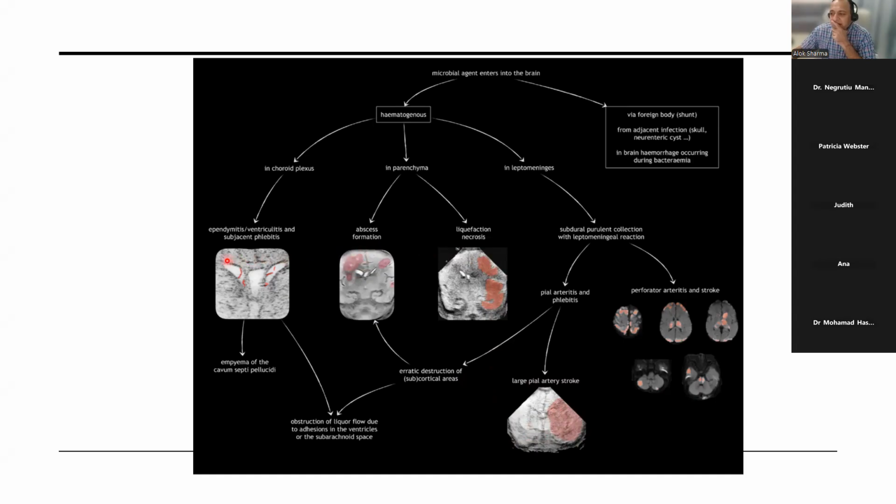And then the third system that you see in the brain is the collecting system, which is the ventricles, which collects CSF. And really, if you start seeing infection there, then you start seeing a brightness to the ventricular walls, exudate in them, or even affection of the choroid plexus. We call it plexitis. So really, it's inflammation there, and inflammation there can cause bleeding. So you can even get intraventricular hemorrhage.